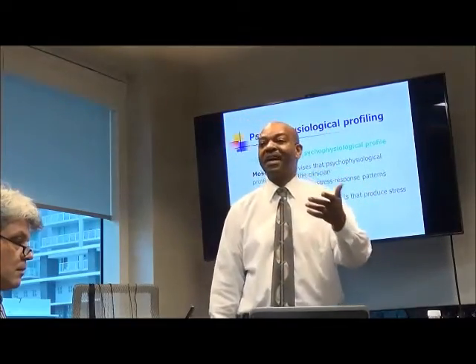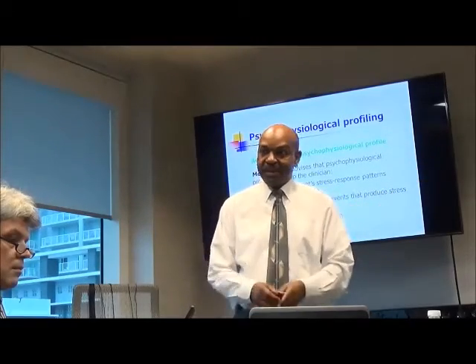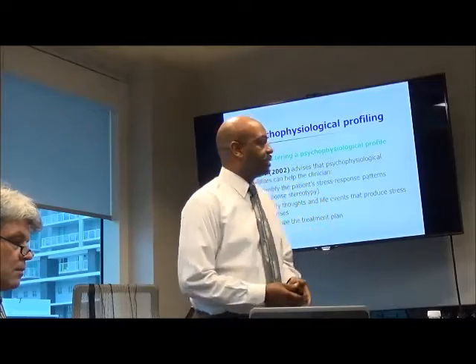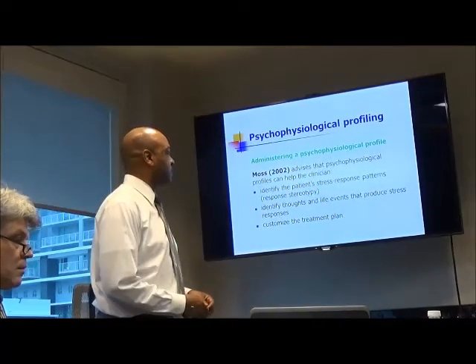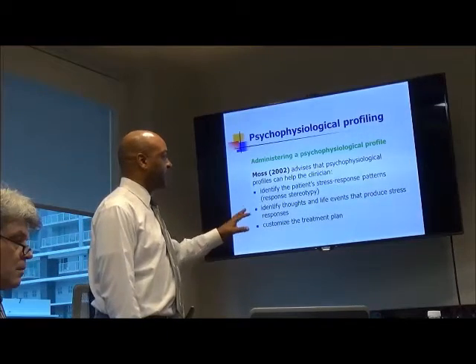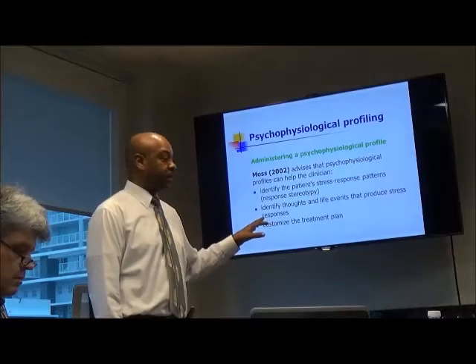But if I had decided that I should do skin conductance or temperature with him, I may not have gotten the chance to work on that. So sometimes you see those things. So the pattern that that particular person responds, also the types of things that are more stressful to them.